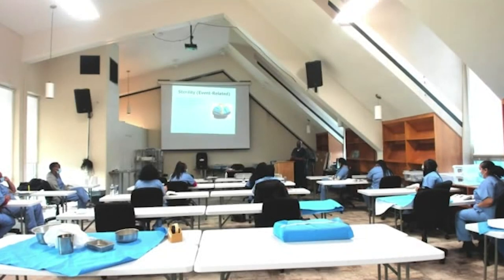Hold on, what did you say? What method would we use? Okay, all right, so we might not have covered this yet. Did we talk about IUSS? All right, that's another class. That's coming up. So it's high temperature sterilization, and IUSS is immediate use steam sterilization. We're going to get to that.